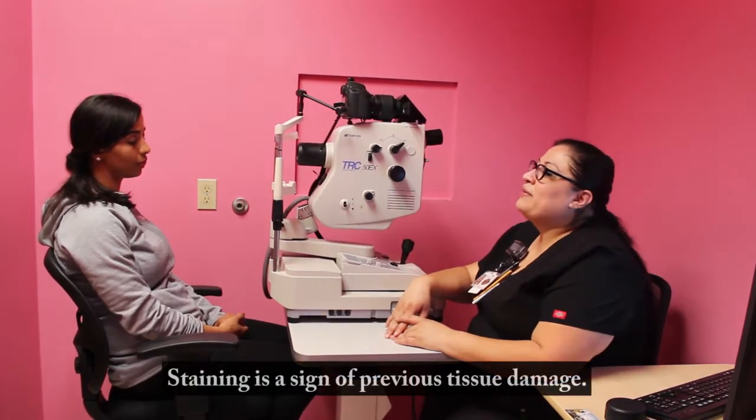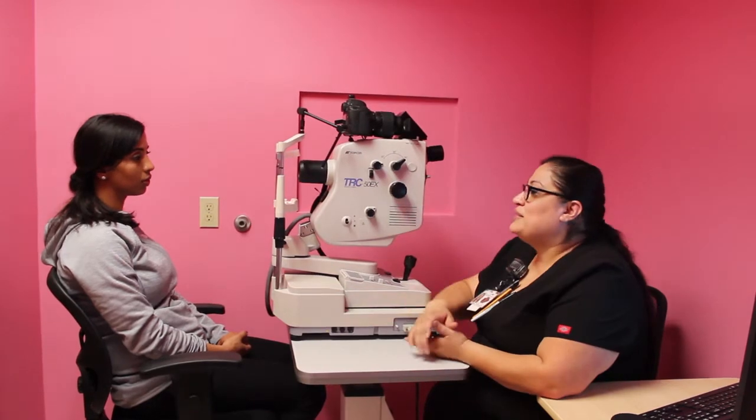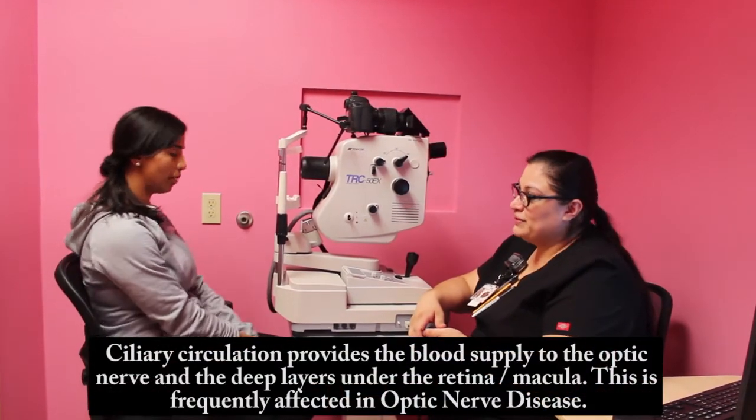Are you allergic that you know of? No. Okay. So what we'll do is we will be taking some pictures before, I will be injecting the dye, and we'll take some pictures after.